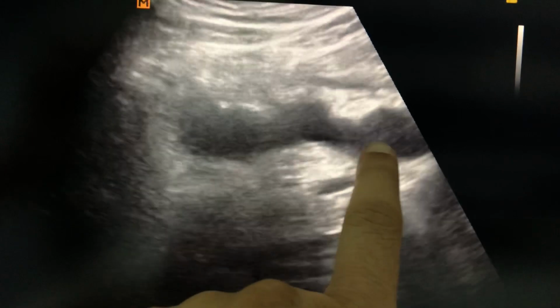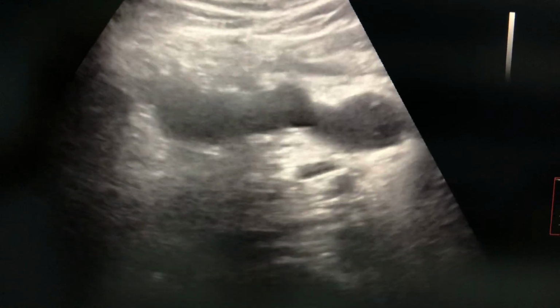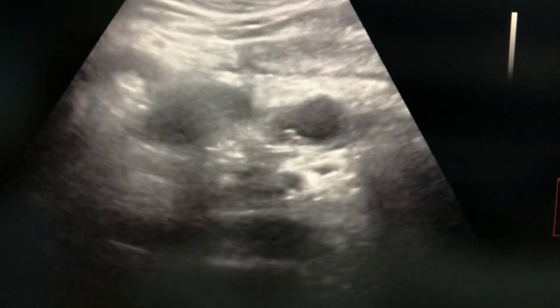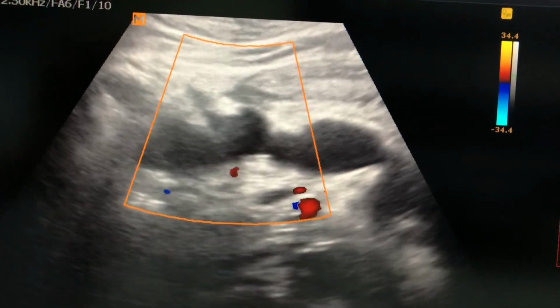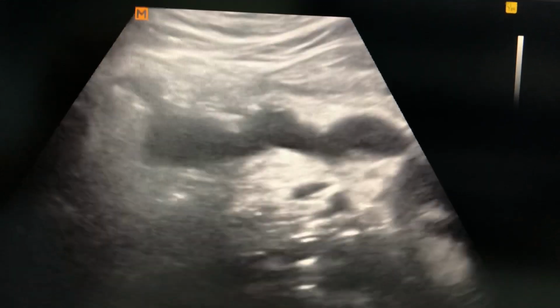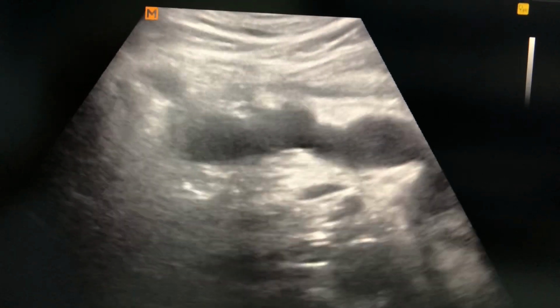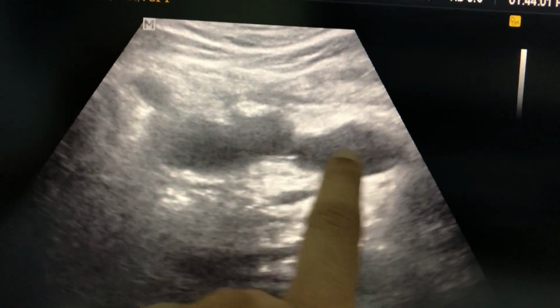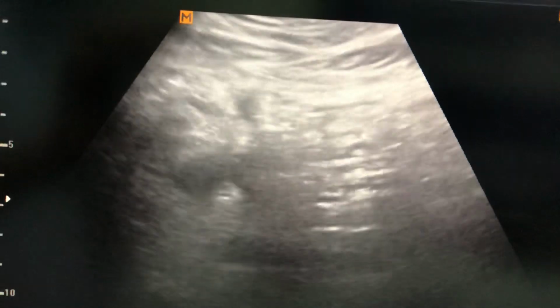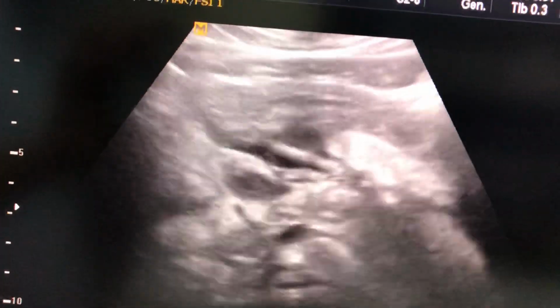And this is the tubular structure, which is the inferior mesenteric vein, which is draining the transverse colon and the descending colon. This vein is showing echogenic texture inside the lumen, and it is due to thrombosis, roughly 11 to 12 centimeters in length. This is dilated also. This texture is very echogenic inside this segment. Normally, if we look at a vein, it is anechoic.